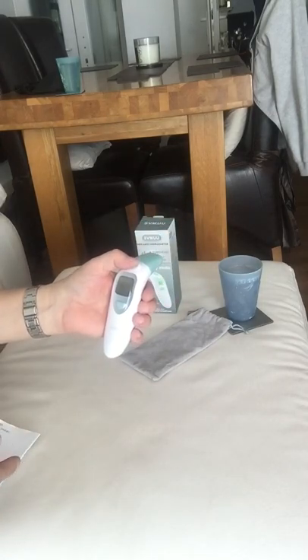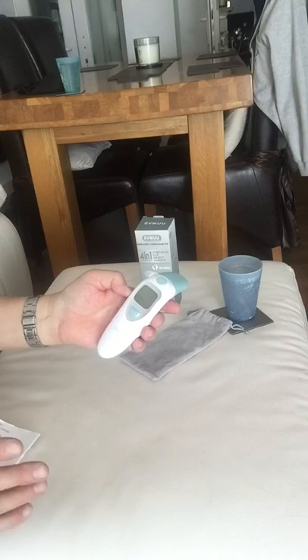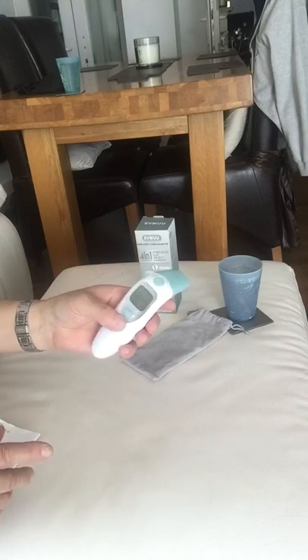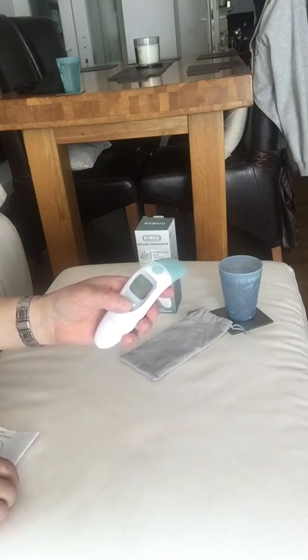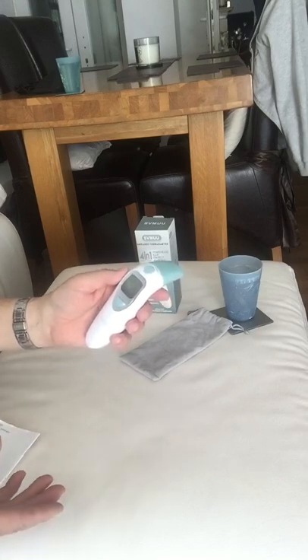It's preset in centigrade. If you want to change from centigrade to Fahrenheit, you press the MEM button — which is your memory button or the settings button — while it's off for six seconds. Once you've held it for six seconds, you take your finger off and press it again. That allows you to change from centigrade to Fahrenheit.